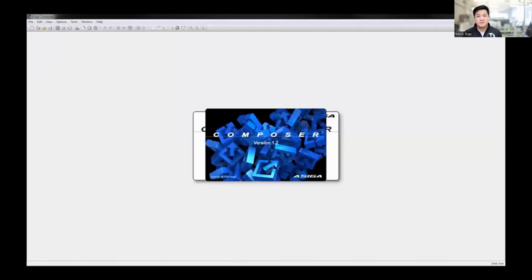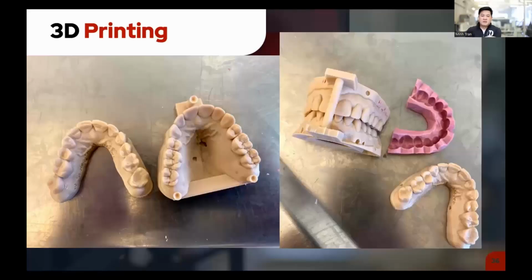And then from there, just overall start to finish, what would you expect the time to design and deliver this case for your doctors? How much time do you feel you have devoted per diagnostic? So are you talking about the finish, or just this diagnostic phase? Let's say starting from actually taking the patient in, getting the photo, doing the virtual smile design, and then moving all the way through the design into printing and post-processing. What do you think this is start to finish?